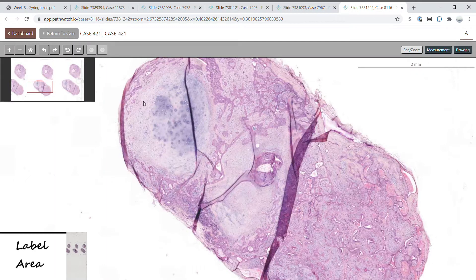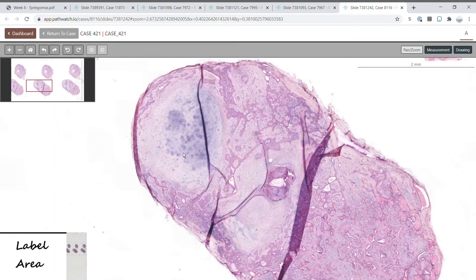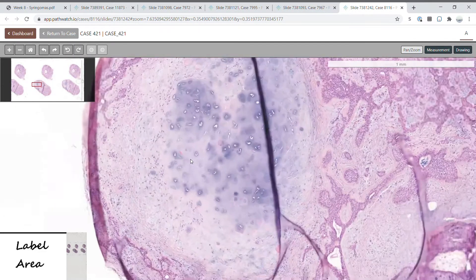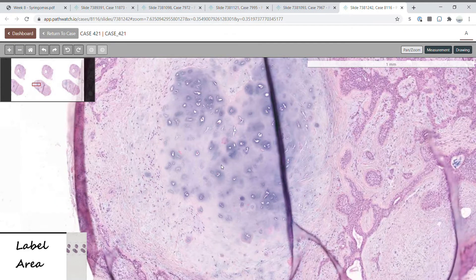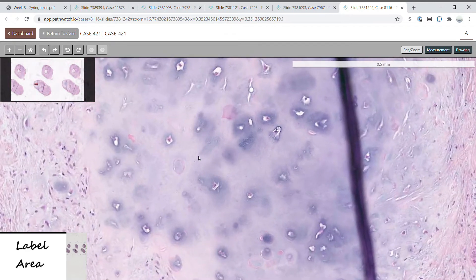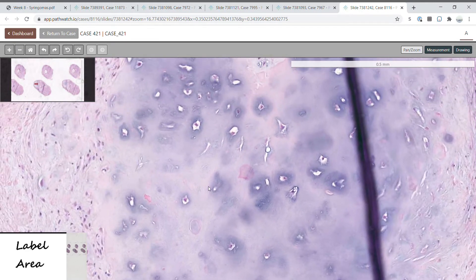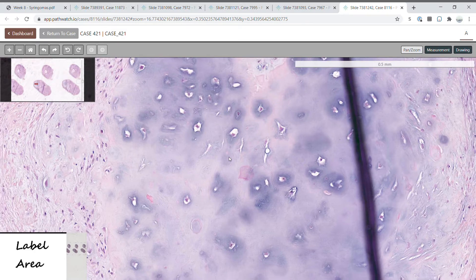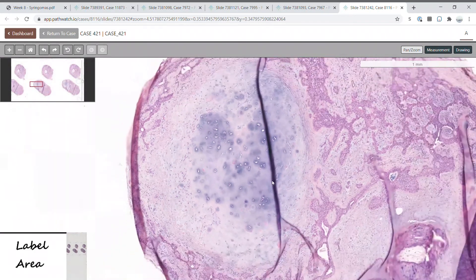Mature cartilage has a different look to it. Here is mature cartilage in another chondroid syringoma. You can see the mature cartilage having a glassy stroma which is both blue and pink, as well as lacunae with chondrocytes sitting in them.